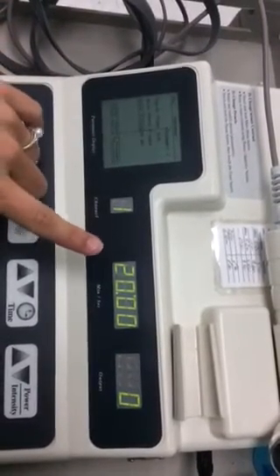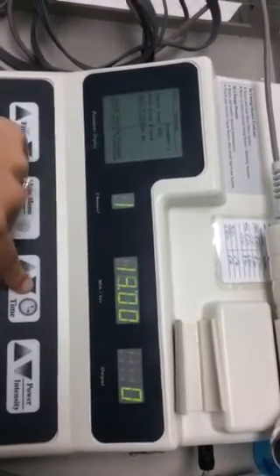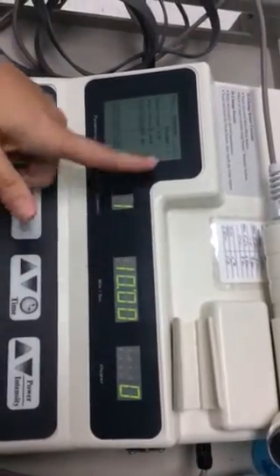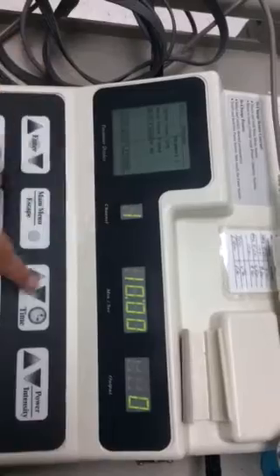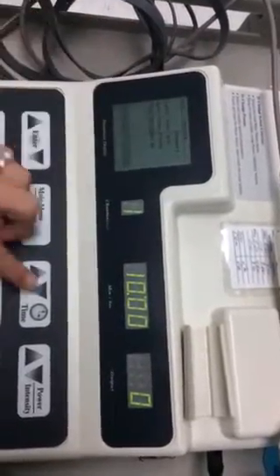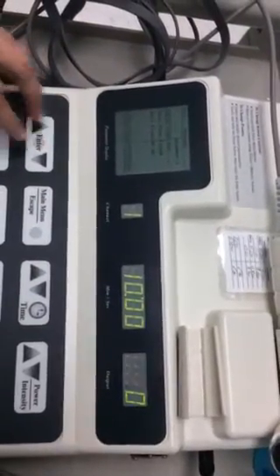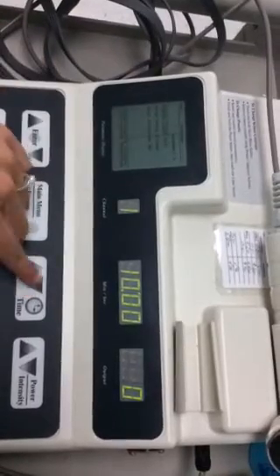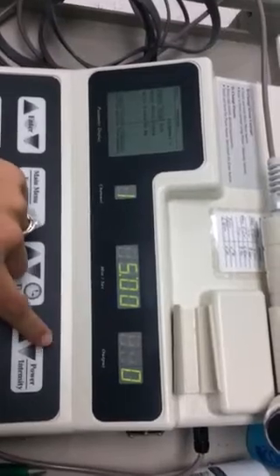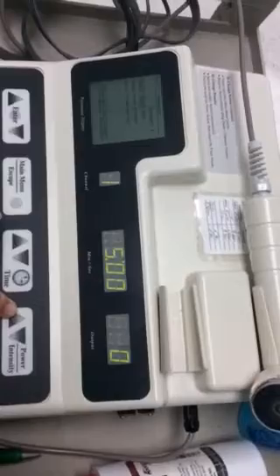Again, you want to change your time. Since you are looking for a muscle contraction, you would like 10 contractions, just like if you're working out. You do a set of 10. We're only 5 on, 5 off, so you might want to change the treatment time depending on what you want. This one you can't change. Do the continuous 5 on 5 off. So you may want to do it more like 5 minutes. That would give you a contraction every 10 seconds.